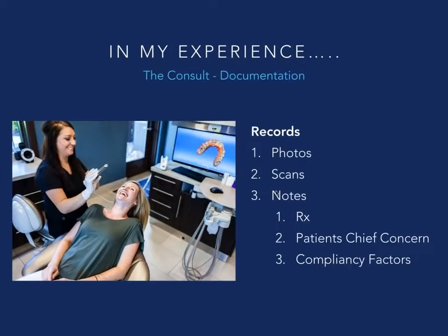So we're going to get into a little bit here how the consultation in our office flows, as far as the records that are needed and what that really turns into for us. We want to have a lot of really nice records so that we can tie in the types of movements we're going to need to achieve during this acceleration treatment. It also allows us to create awareness by educating patients on existing conditions they weren't even aware of.